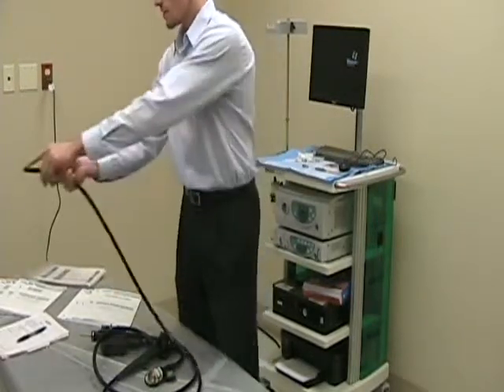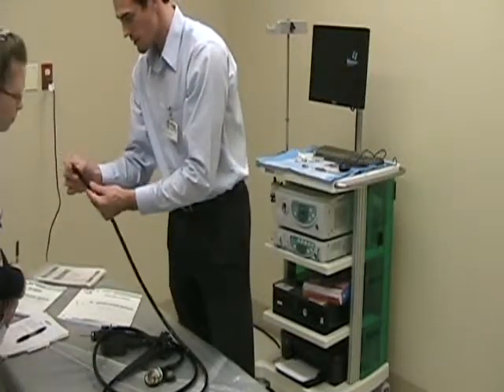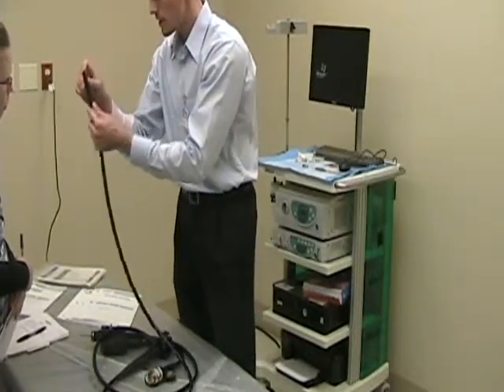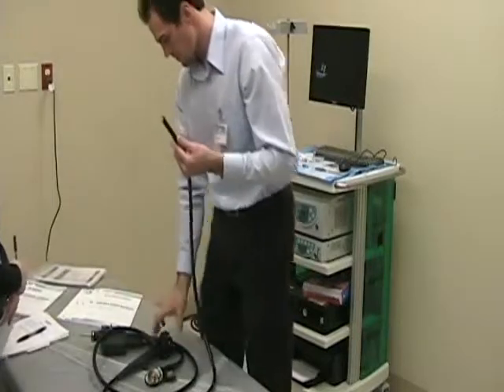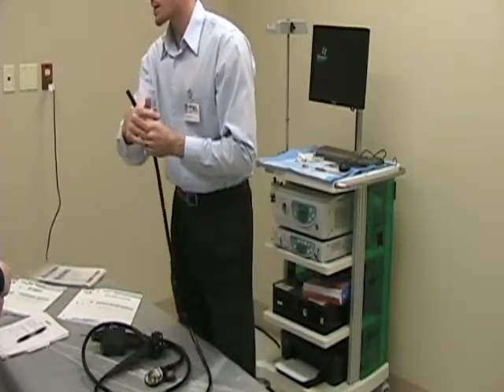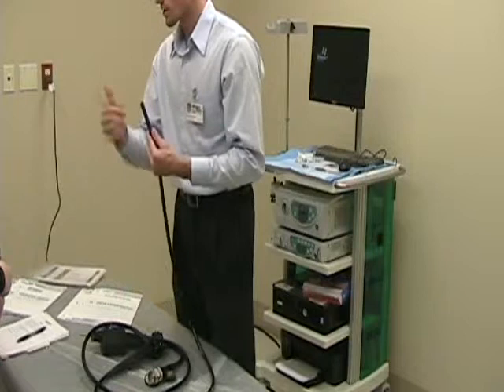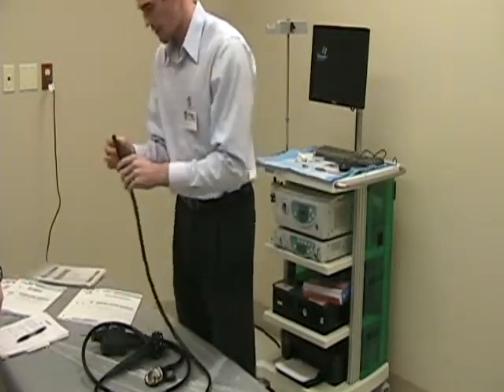So if everybody wants to look real quick, for those who aren't familiar with it, there's quite a few parts on here. There's this little elevated part you see. That's a nozzle, air-water nozzle. The doctor will, if he covers this blue button, it will inflate. The minute he depresses it, it will squirt water out of it and clean the lens, because you're getting all kinds of junk on there. So clean the lens, depressed, and then if he releases it, water or air just to inflate.